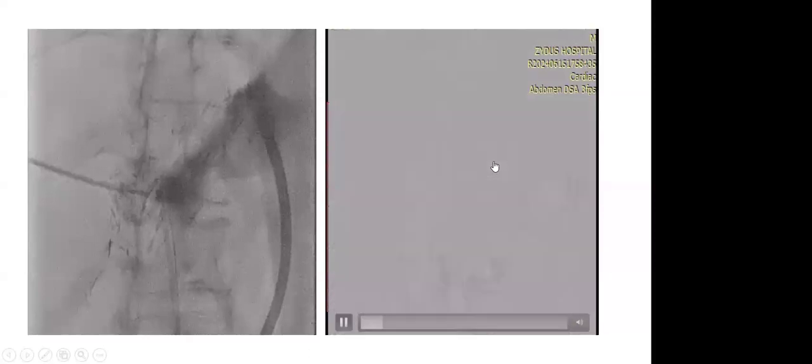So this is actually a very rewarding thing, because over time that bile leak will heal once you put the stent across the leak. And after three months, they usually do it internalized. So via ERCP, they put the stent after 3 months, and that will be kept for at least 9 to 12 months, and changed every 3 months. So the bile leak will heal once you put a stent, because healing will process around that tube. So this is another second biliary intervention.